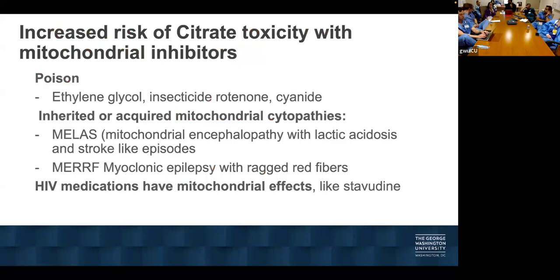You said that's in the system, right? Yes, it's gonna be under that. So it's gonna be next to each other, the filter. There will be the systemic ionized calcium, the post-filter ionized calcium, and the ratio. It's all gonna be next to the CVS. So there's increased citrate toxicity.